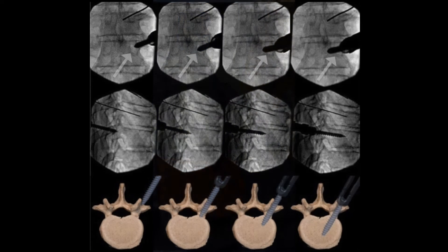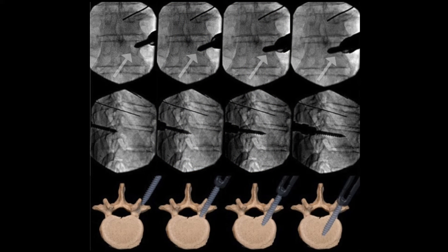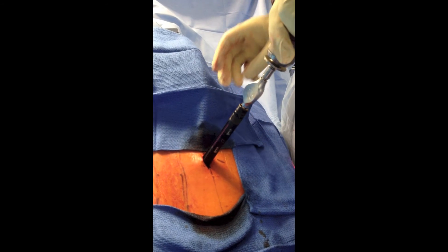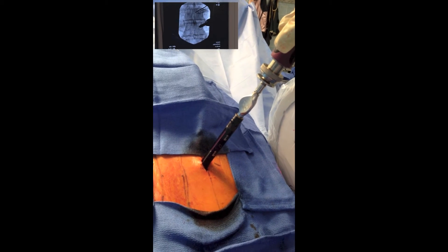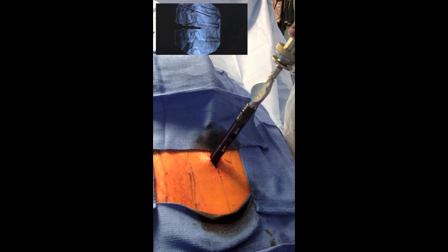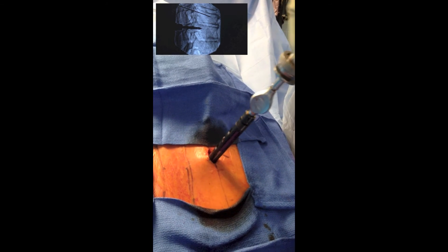This is a diagram showing the basic progression of a percutaneous pedicle screw placement. Note how the medial wall of the pedicle is not breached until the screw is within the vertebral body. Multiple fluoroscopic images are taken to assure an appropriate trajectory is maintained and the medial wall of the pedicle is not breached prior to entering the vertebral body.